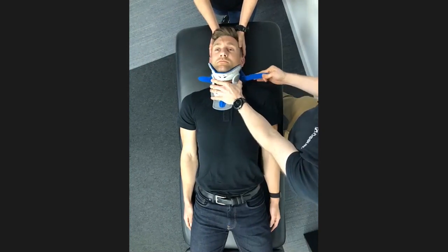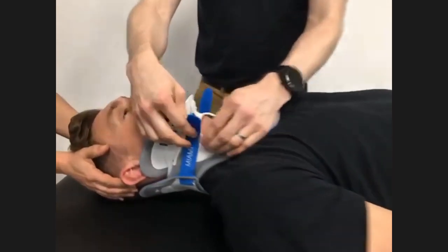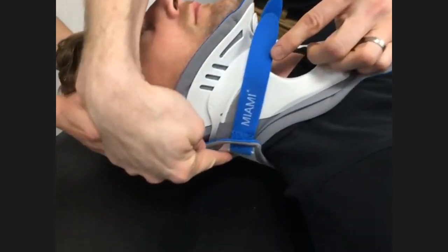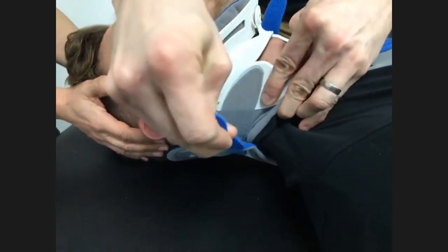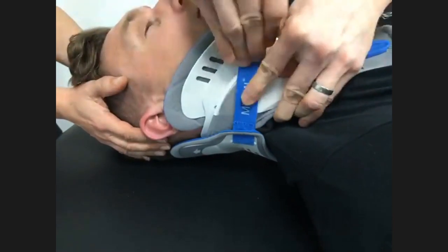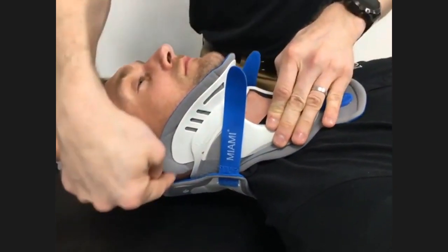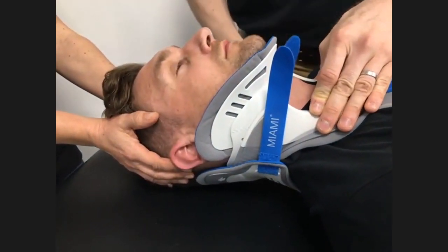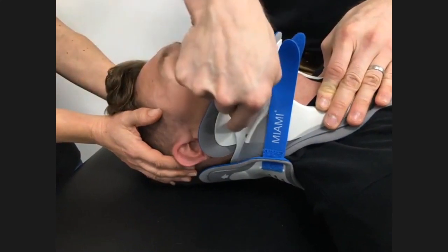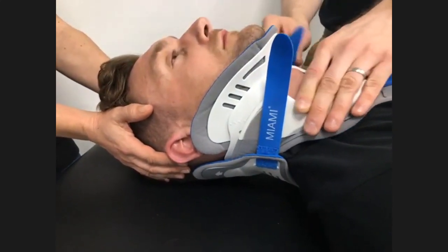And if we move over to the dynamic camera with Izzy, just come from one side, what's really important is we're making sure that we're not applying pressure at this bottom section. So as we undo it, we lift this section up to make sure that it's sat nicely with the jawline. Now, in this case, you can see this small section is just covering Pete's ear, so we can adjust that if we need to. And these sections can be trimmed to make allowance for the ear.